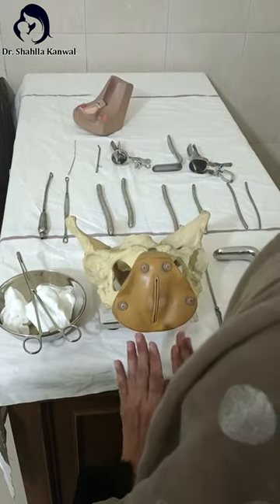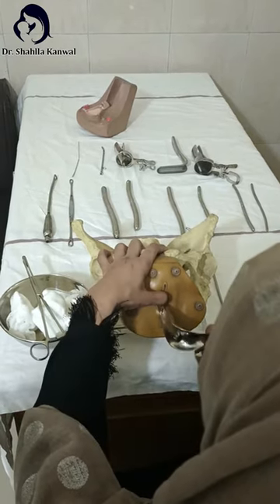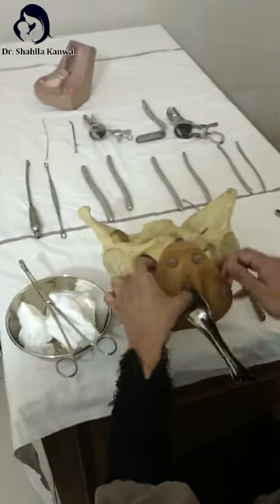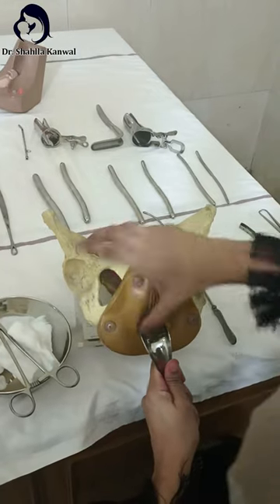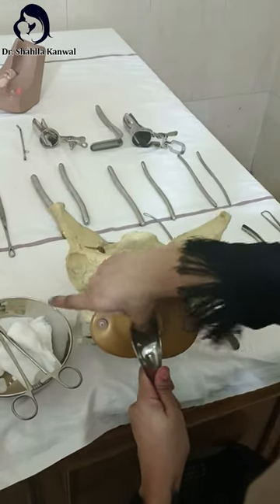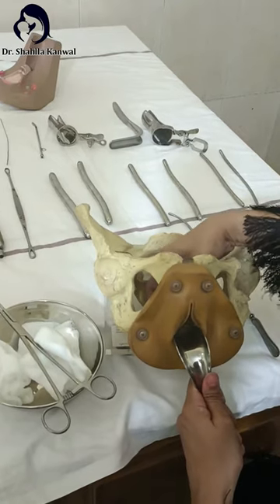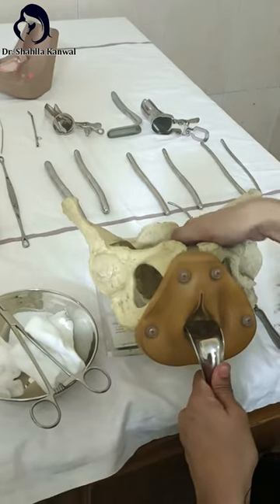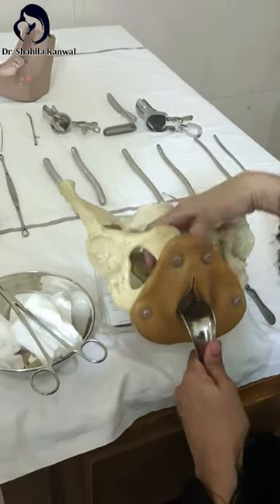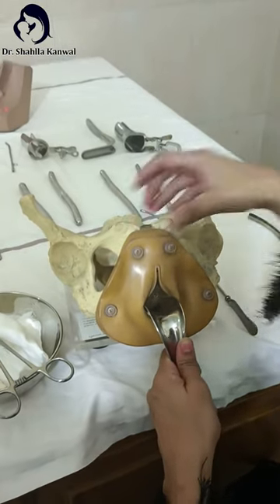During the bimanual examination, under anaesthesia and with the bladder emptied, protect the posterior vaginal wall with the Sims speculum and ask your assistant to hold it to visualize the cervix. This step is the visualization of the cervix. You can see here — I have tried to visualize the cervix in this dummy. The assistant will hold the Sims speculum to retract the posterior vaginal wall.